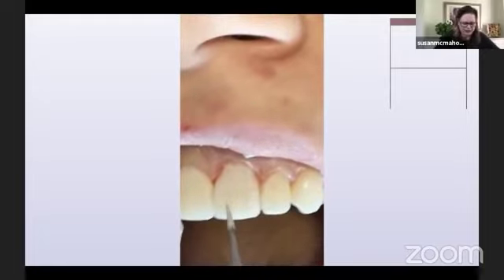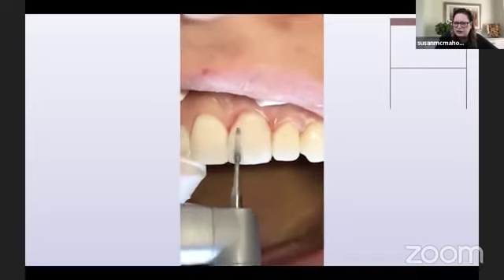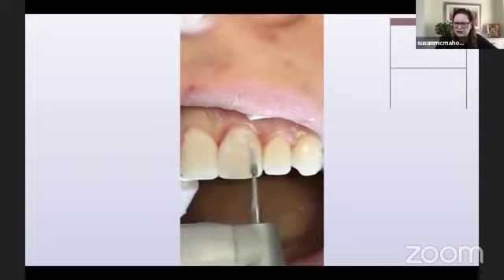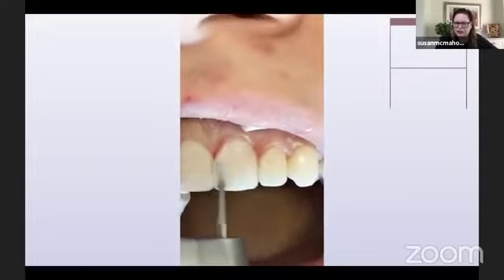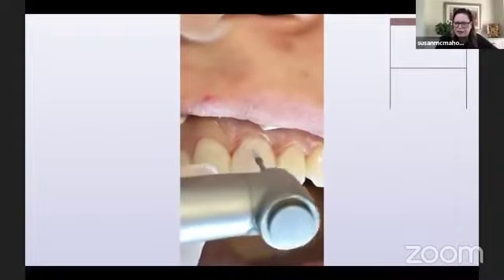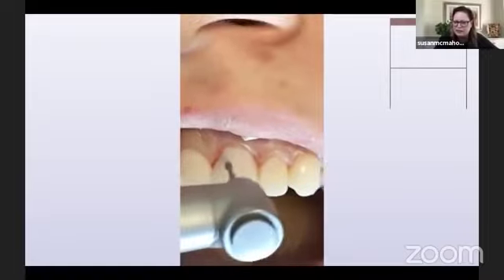I want to watch that video again. So first the lobes. Then the whole surface. And then back and forth, back and forth, back and forth. And you have to do that a lot of times.